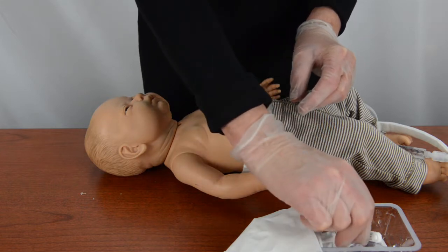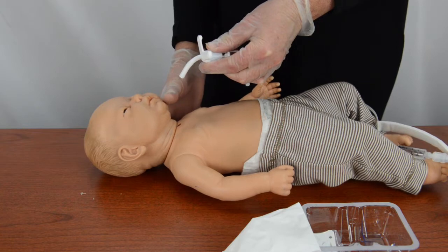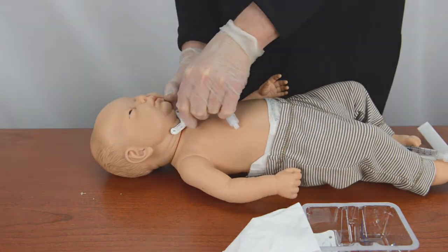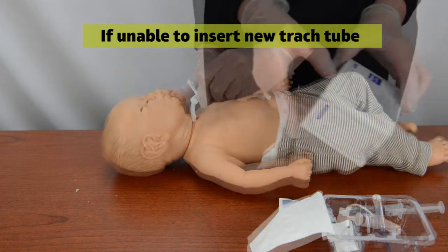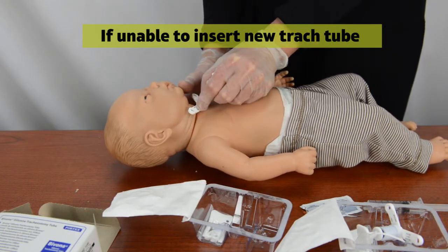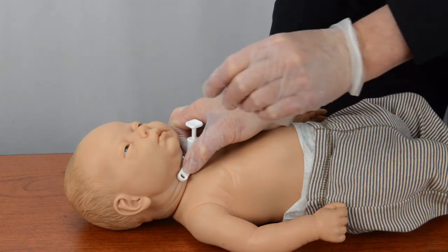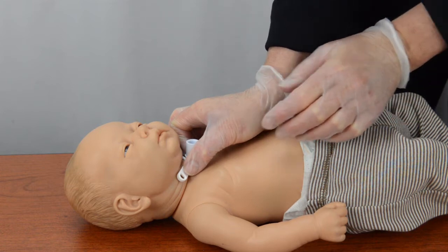Pick up the emergency trach tube by the obturator and hub. Insert the new tube into the trach stoma with a motion that follows the curve of the tube. If you are unable to insert the new trach tube, quickly open the size smaller trach tube and insert into the patient's stoma. After inserting the new trach tube, hold the flange with one hand. Immediately remove the obturator with a motion that follows the curve of the tube. Set the obturator off to the side.